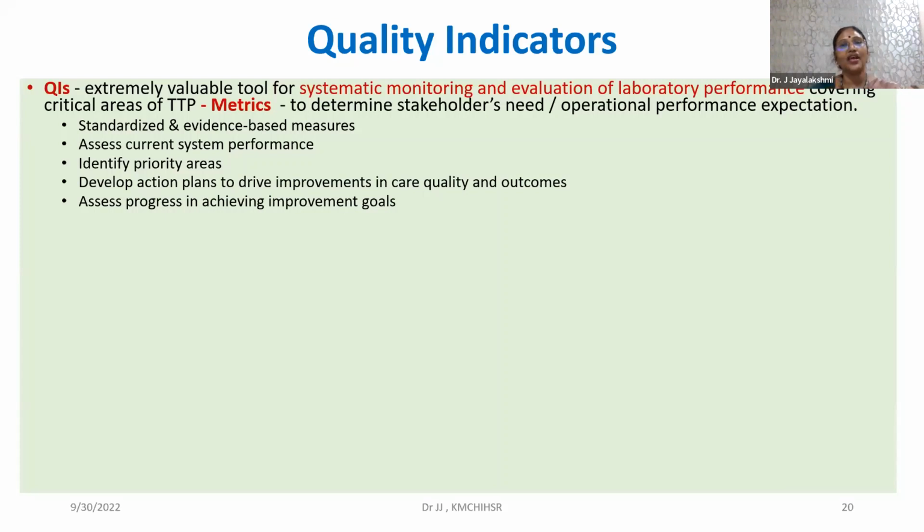So everything has to be together in the quality indicators that you have chosen as a tool for assessing the laboratory. It has to be standardized. Standardized meaning I do, my friend does, my colleague does, my junior colleague does, the newer person does. They all capture the same way. And then it has to be evidence-based. Okay, I should have some kind of evidence on why I'm doing this. Why should I be capturing this particular measure, right? So the standardization is an issue lots of times.